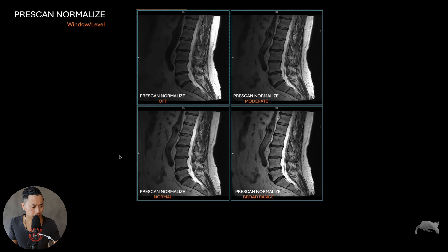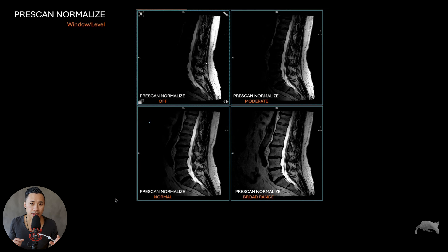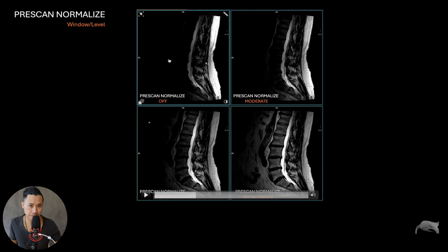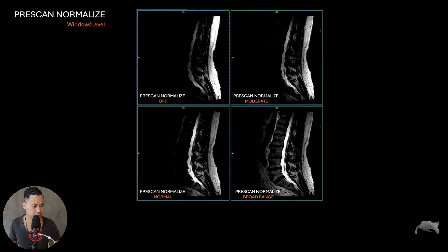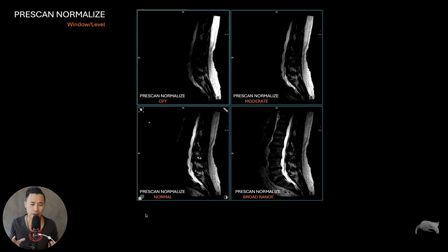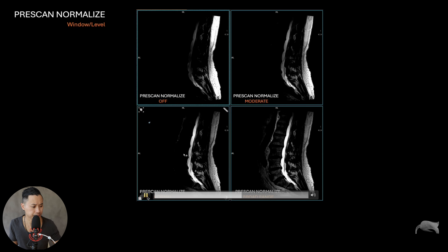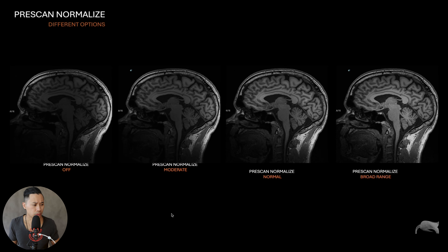I want to show one more thing — this is a window level change so you can clearly see what happens. The window level is totally identical across the images here. When it's off you get burned very fast in the area near the coil, which is still bright. On moderate it's a little bit better, on normal it's getting even better, and on broad range it's getting better and better. For spine imaging I usually use broad range. This was done on 3T, so on 1.5T also take a further look — pre-scan normalize should be set, but play around with broad range to see if it fits better there as well.